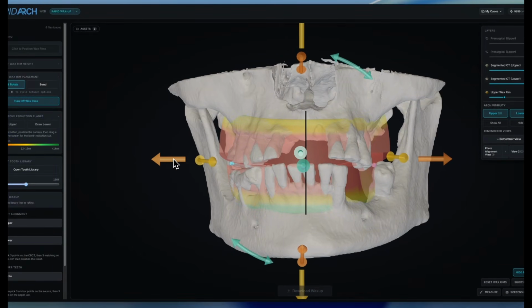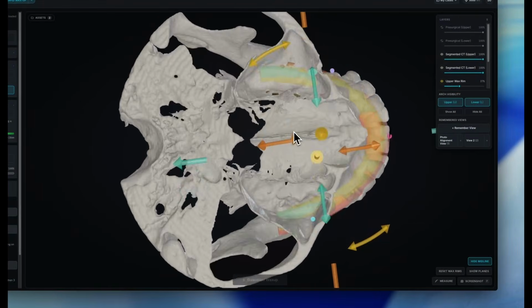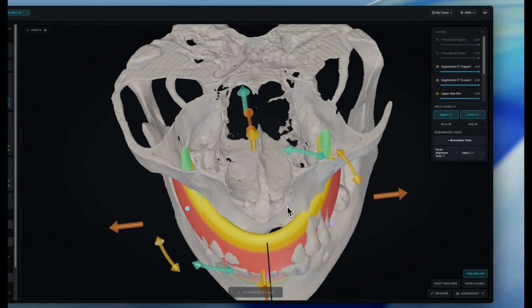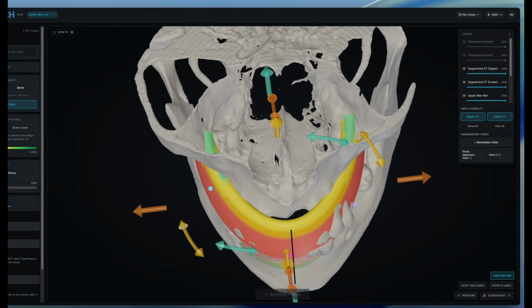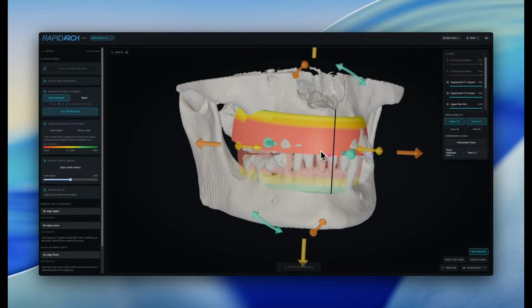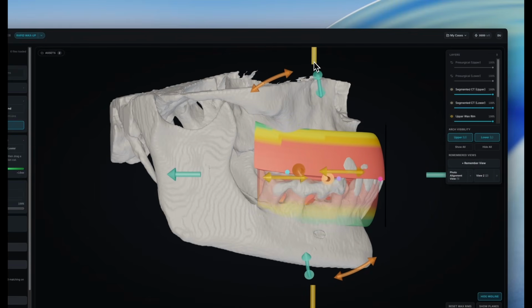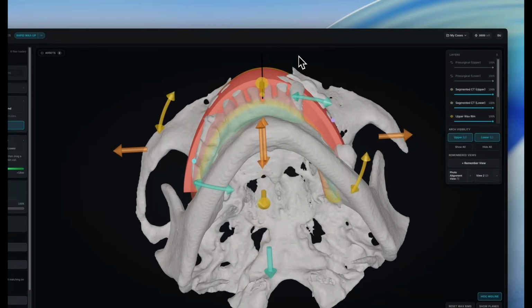And what I'm evaluating here is pretty much the way that we do dentures as well with the wax rims. It's the analog technique. And we're looking at the incisal edge position. We're going to be looking at the posterior occlusion, the curve of Spee, how it follows the patient's lip lines. I don't think I have to explain this one too much. It should be pretty self-explanatory to everybody here. So I'm just tilting this a little bit so that I can get the occlusal scheme a little bit more in line with her existing dentition.